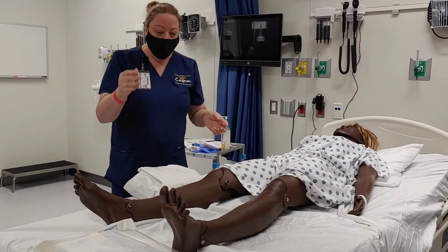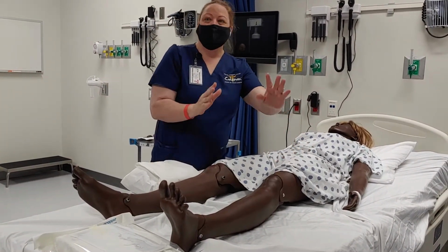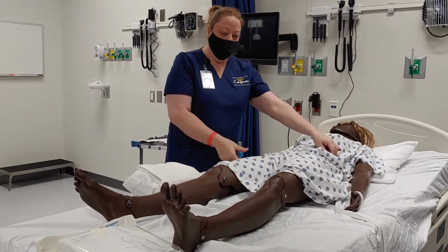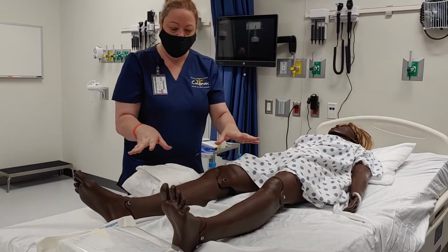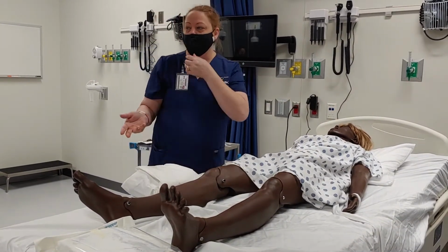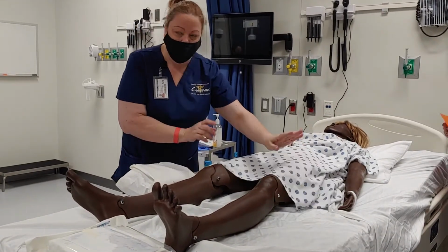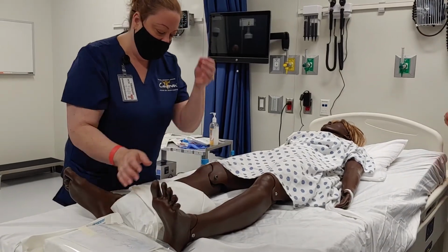Okay. So typically, I would have the sheet pulled up here, close to my working area. Okay. I can also have the gown up here to cover up the upper portion. All right. But I would only expose what I absolutely have to have exposed. All right. So I'm not going to do the exposing yet. So I'm going to go ahead and get this in position.